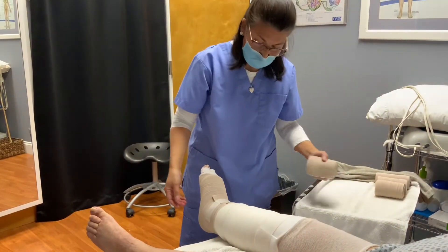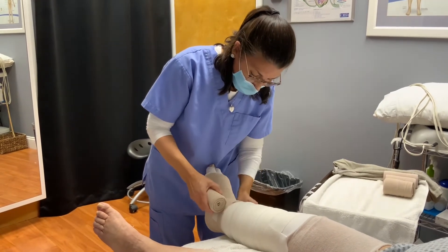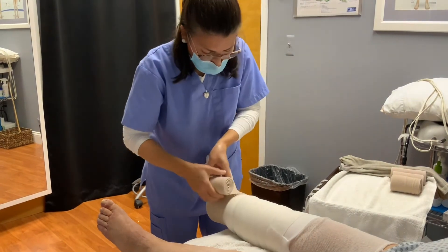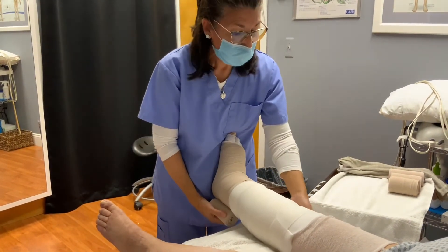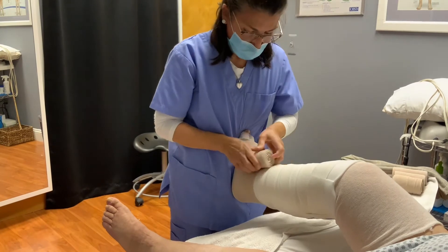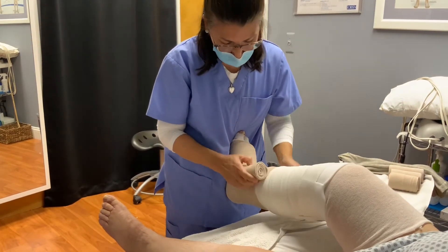Then we're going to go to the second one, which is a 10 centimeter. With this one, we're going to start at the ankle and keep going up. I'm going to have you bend your knees slightly. And then you cover 50% of the bandage every time you go around.